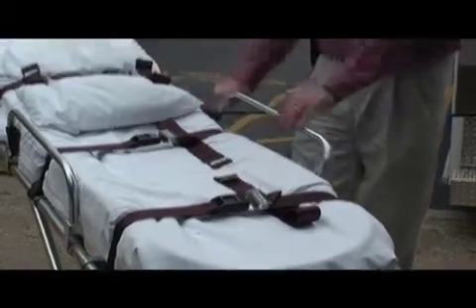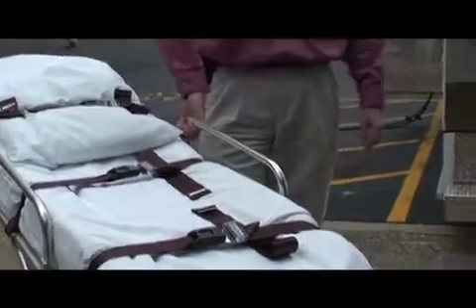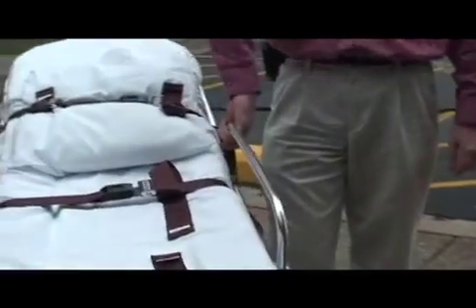If for some reason you need to raise and lower the rails, this stretcher has a plastic rail guard, so you can pull there. The other stretcher does not, and you can just pull this pin. When you pull the pin, then you pull the rail down, and then you can slide it back up. If for some reason it gets stuck, you just pull the pin out, and it will allow it to go back in.